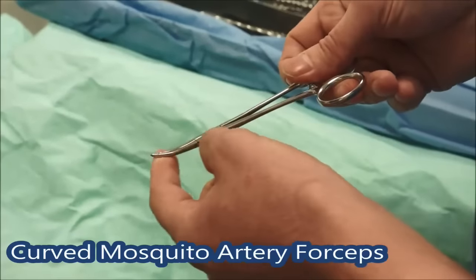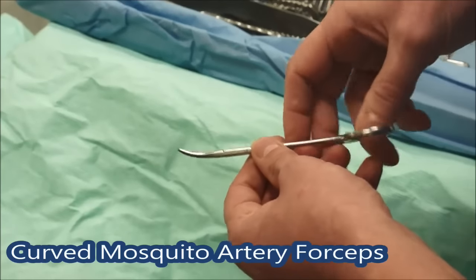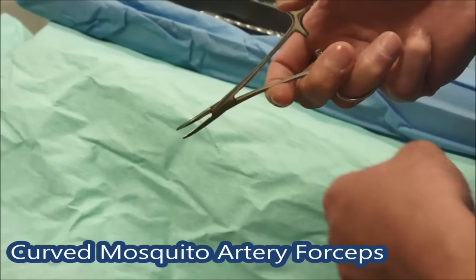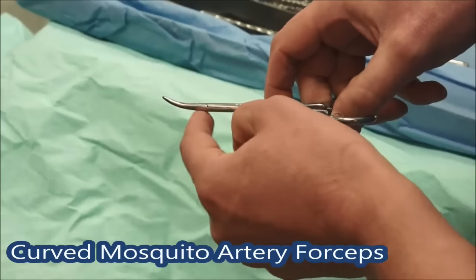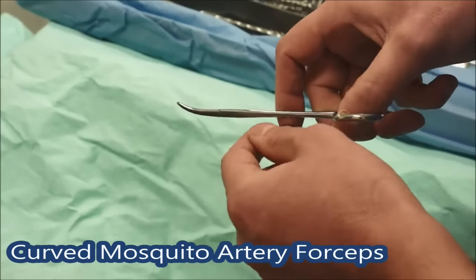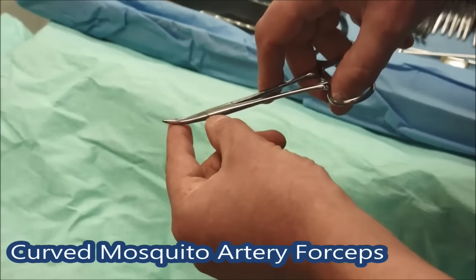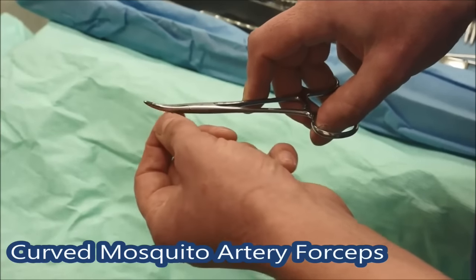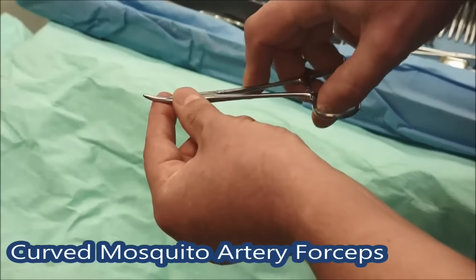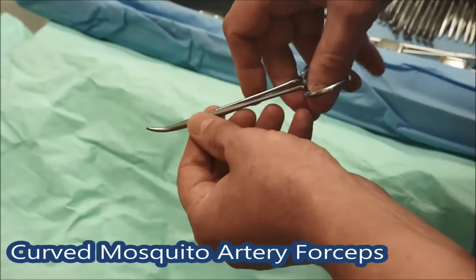These are the smallest clips on the tray — a pair of curved mosquitoes. They might be called something different in your hospital. These are really good for getting across small blood vessels; you put across two small blood vessels and then cut between them. The curving on the end helps you get the suture underneath the tip of the clip so you can tie behind it and let it off. When you're assisting and someone's putting a suture on, just gently lift up the tip so the person suturing can easily get the tie underneath. If someone says 'show me the tip', that's what they mean — just hold it up a little without pulling it off the tissue.